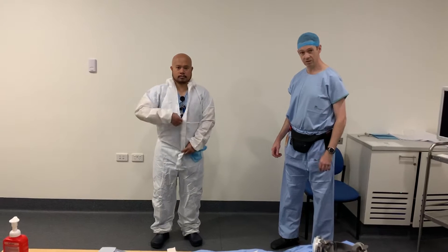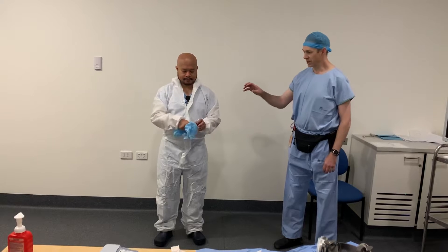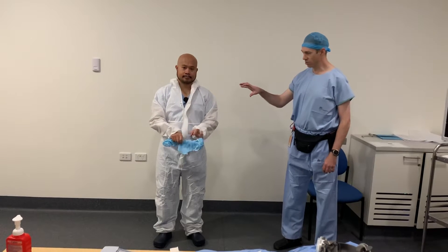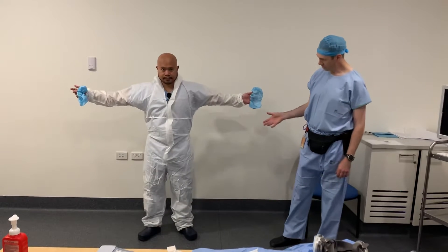We're going to start with donning. We've decided to use the coveralls, and in the anaesthetic department first, when we get a call, we don these coveralls. Just put them on, put your shoes on, and then don over shoes.